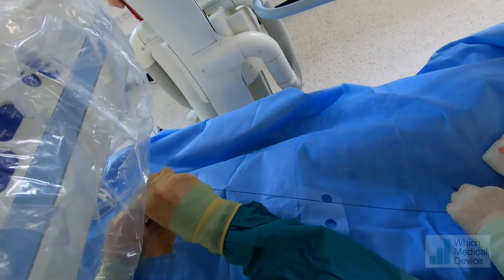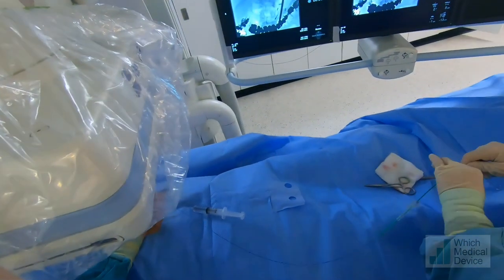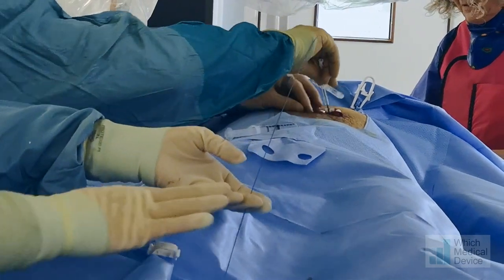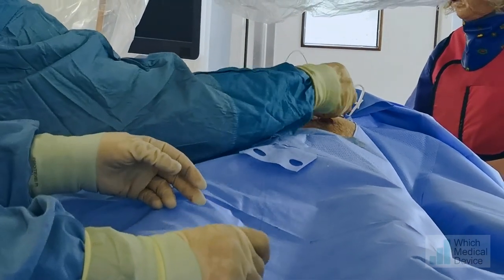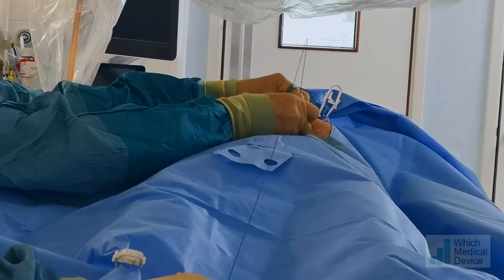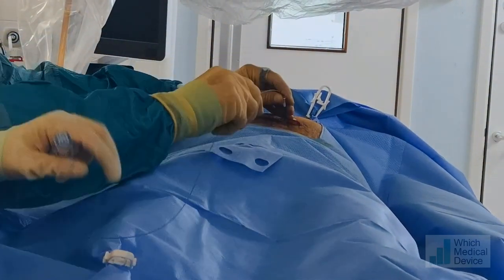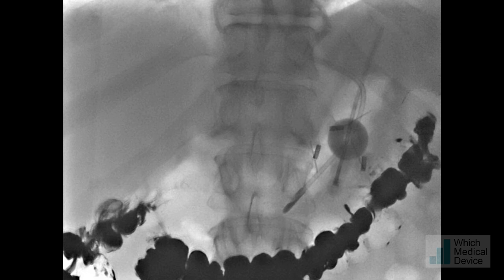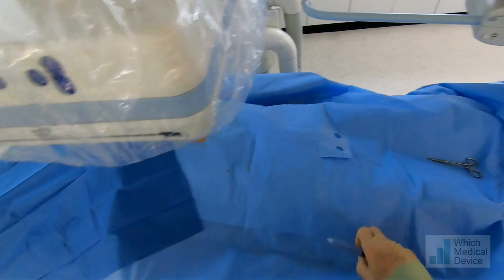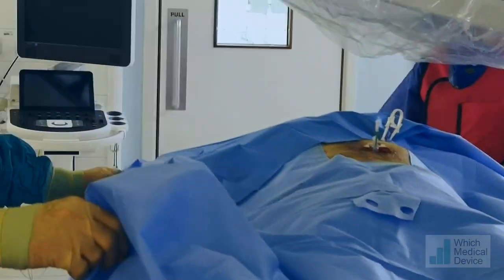Taking that dilator out and putting a little more air into the stomach. We're now going to push the tube in with a rotatory movement over the dilator — and that's the gastrostomy tube in place. Keeping forward pressure, I'm going to inflate the balloon. Leaving the dilator in because we know it's in the stomach. Taking the wire out and checking position. We'll get some more air and screen laterally to confirm the balloon looks like it's in the stomach.